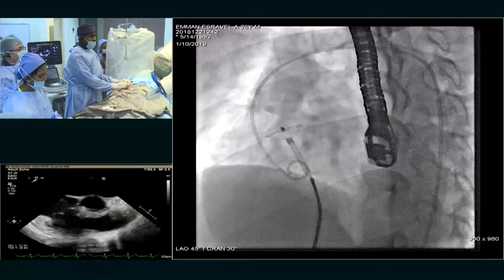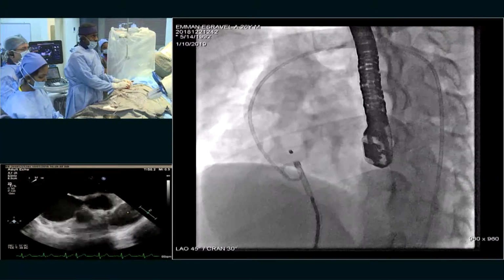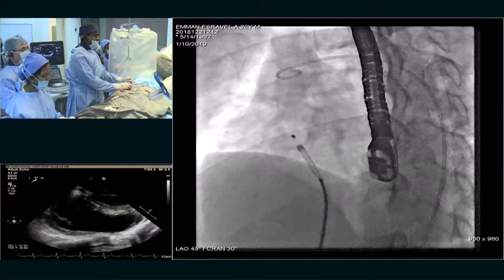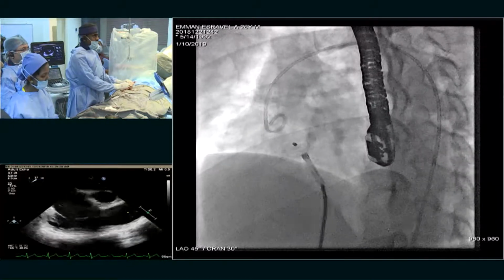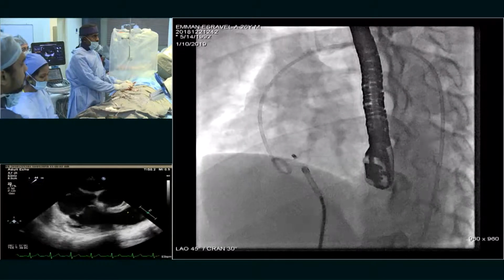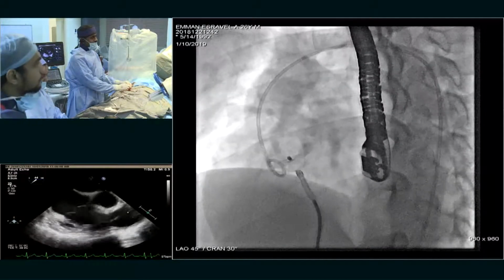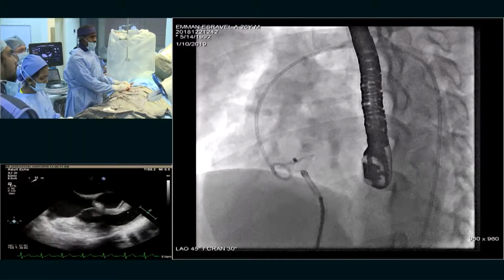And see, right now I am coming down. I have got a pressure monitor. So now we are touching the pigtail. I will just withdraw the pigtail. Yeah, I don't know how to exactly time it in the systolic opening of the aortic valve.